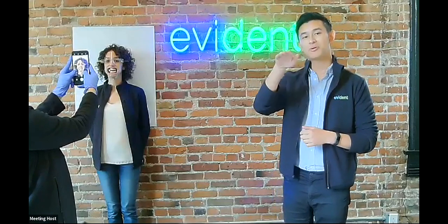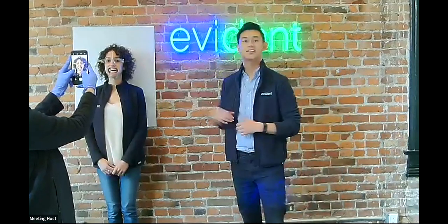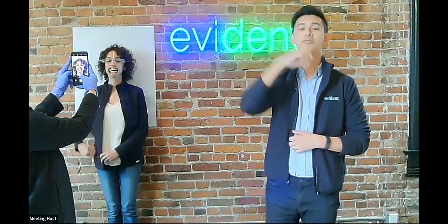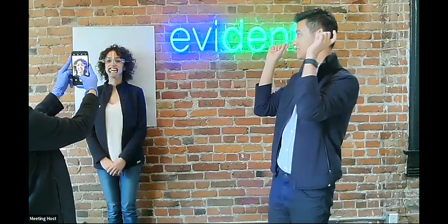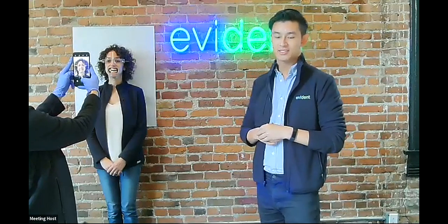So taking the top horizontal line and aligning it with their eyes and the fins of the glasses, that works great. But an easier way to remember is if you zoom in just enough that you see their mouth, but you leave enough space around the face, so above their head, below their chin, and beside both of the fins of the glasses, that's enough space for us to work with. So the first photo you need to take is the retracted one, which we have here.